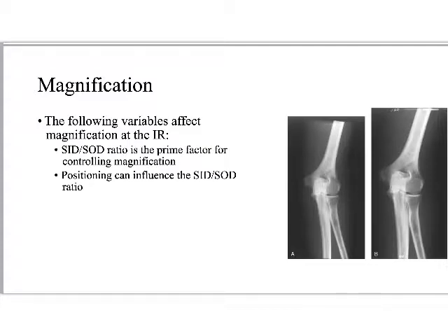One of the great examples of that is a PA chest x-ray. What has an increased OID on a PA chest x-ray that we might not want superimposing other things? The heart's actually closer, but what's further away is the thoracic spine, right? When I'm doing a PA chest x-ray, I'm not interested at all in the thoracic spine.